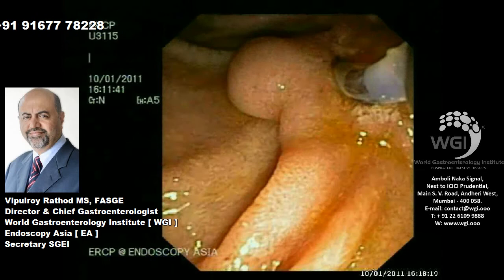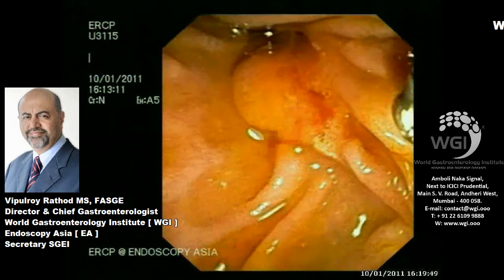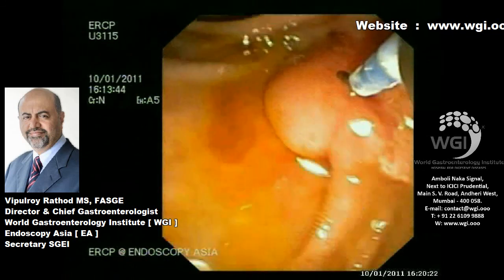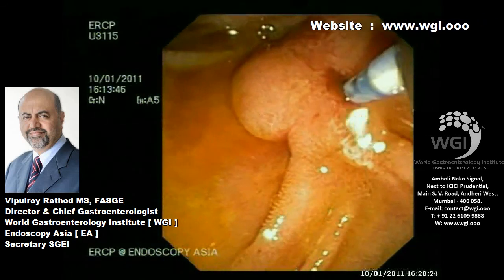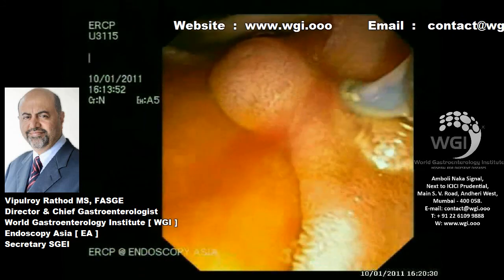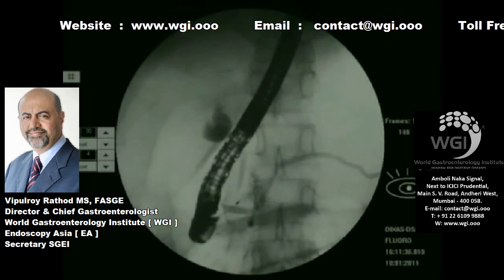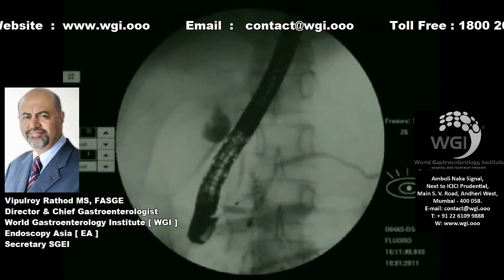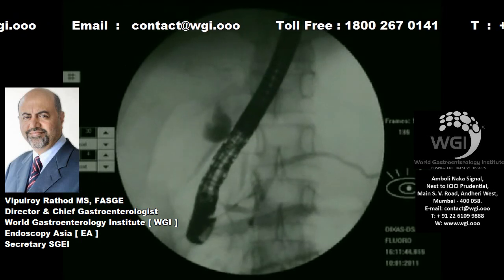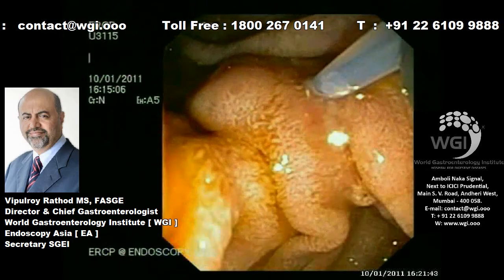We will now try to cannulate the major papilla with the guide wire. It is our standard practice to cannulate with Terumo, and I prefer to use a cannula in such situations. You can see I am trying to get into the major papilla and going into the duct where there are a lot of stones, and it is not easy to maneuver through those stones.